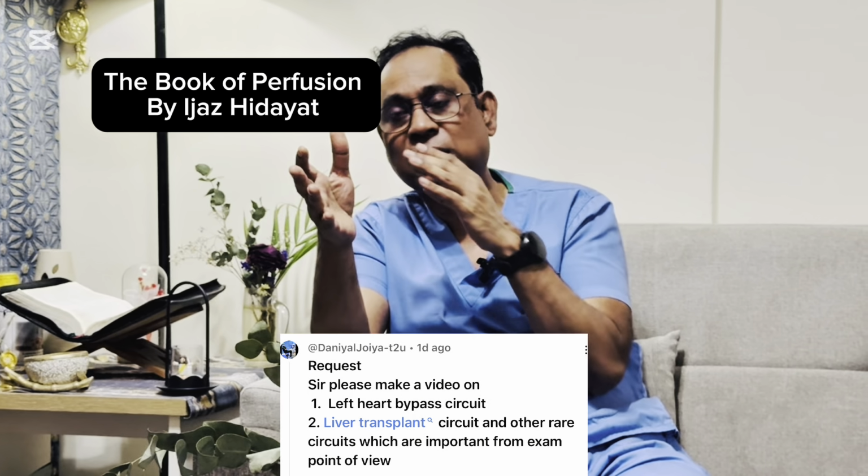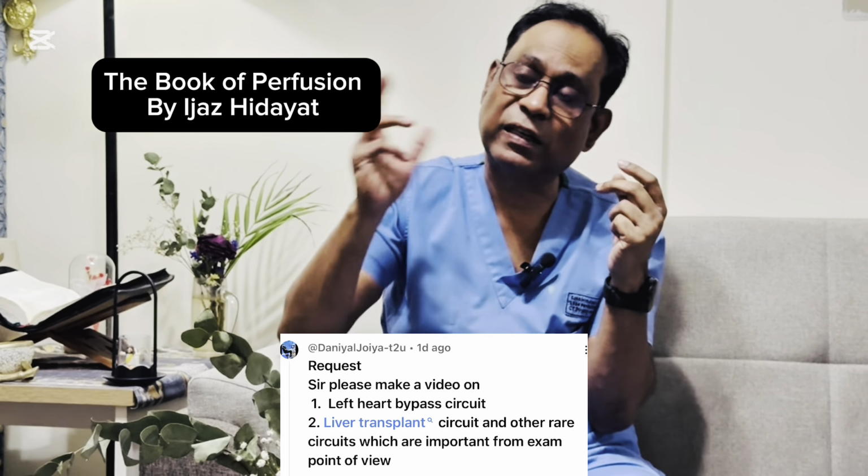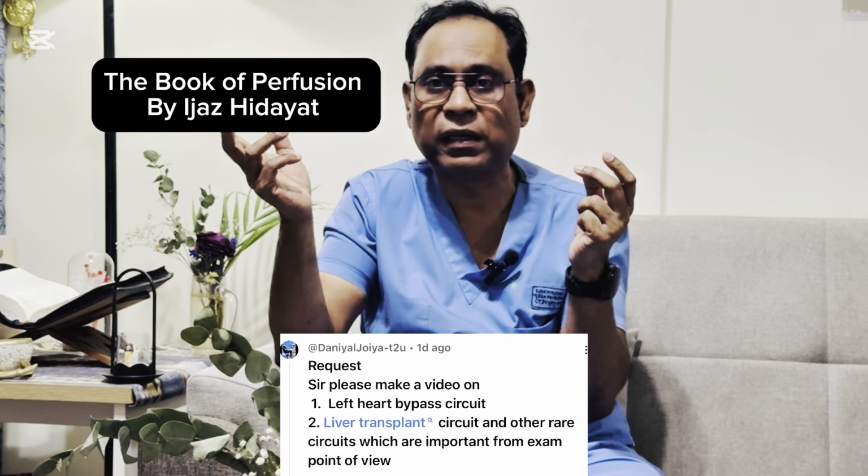What is the major difference of the left heart bypass? In left heart bypass, we cannulate either the left atrium or the pulmonary vein. But in a conventional bypass, we cannulate the right atrial appendage, meaning the right atrium, or sometimes bicaval, SVC or IVC.